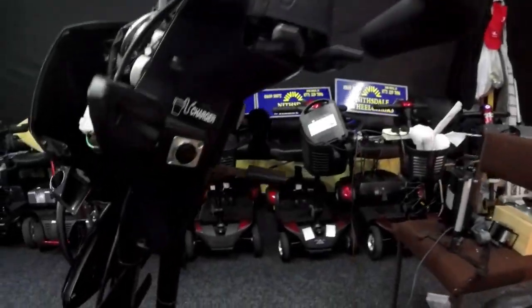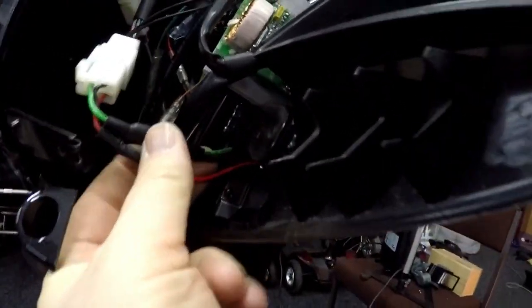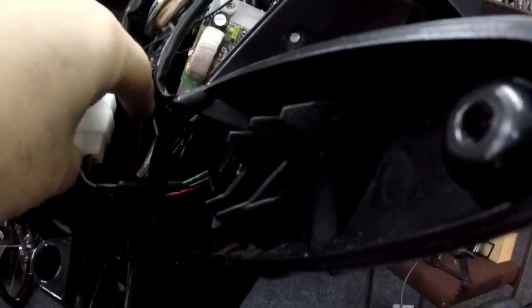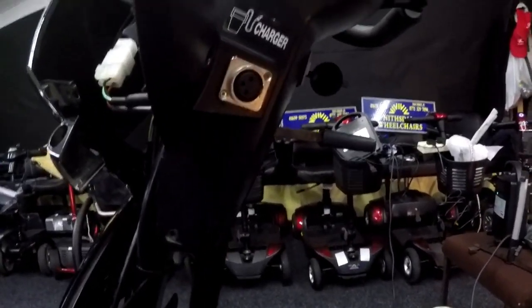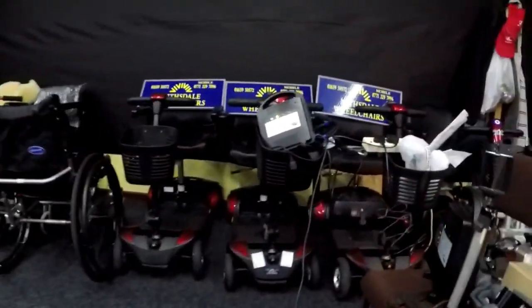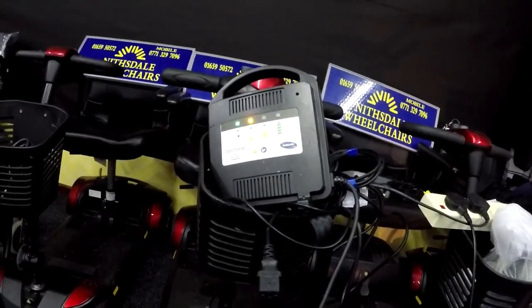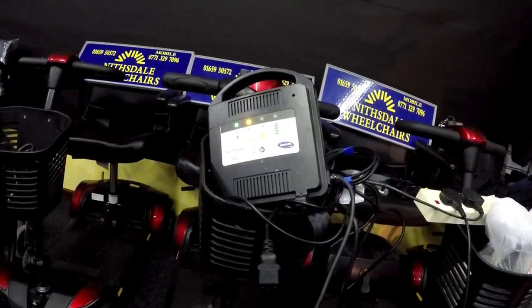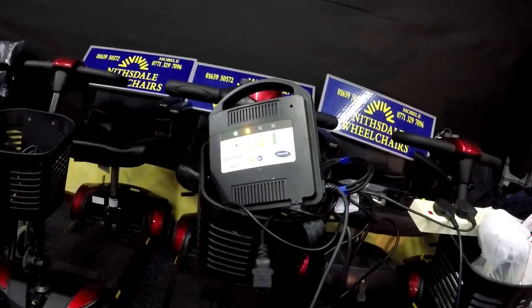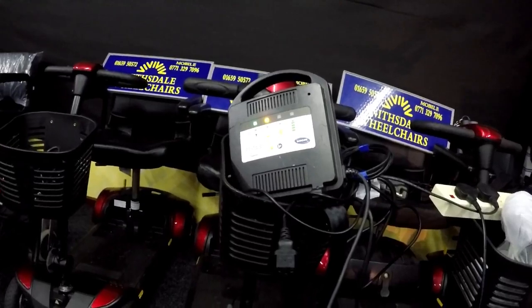So now that I've fitted the new connection on here and joined it up to the old terminal connection, it's got a proper fit in there. We'll reattach the original connection on here, and hopefully now this light will not go off and it will fully charge, and I'll be able to test the batteries later on. So it's a perfect fit, light doesn't go out. We'll leave that on overnight till tomorrow and see how we go on from there. Hopefully the orange light will not come back on.